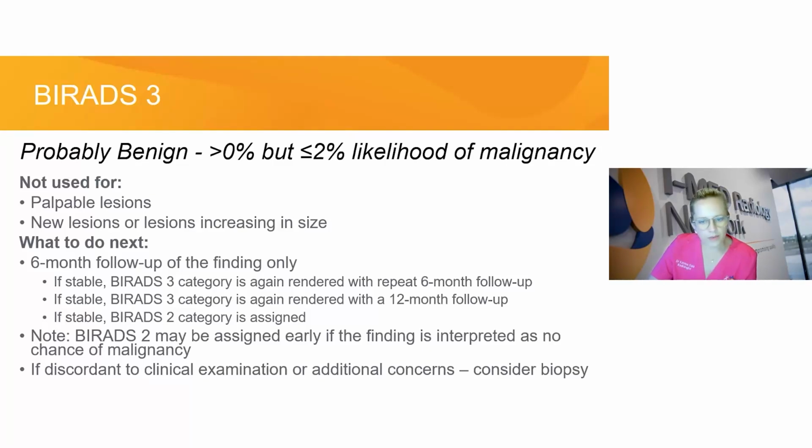And this is where I think it's very tricky. So the ruling is that you should really only use a BI-RADS 3 on the first imaging, and everything after that, because you've got a comparison study, you really should be able to assign it as either slow growing or stable in size, or reducing in size, therefore benign, or it's new and we're suspicious about it.